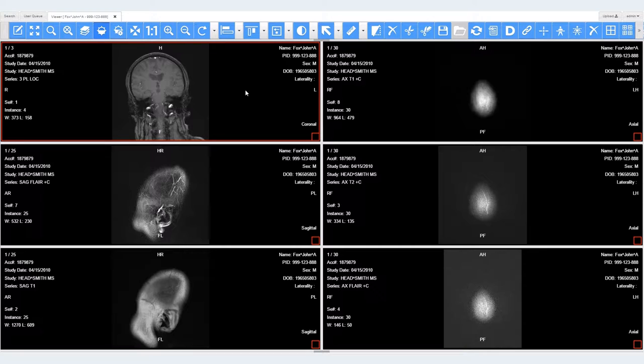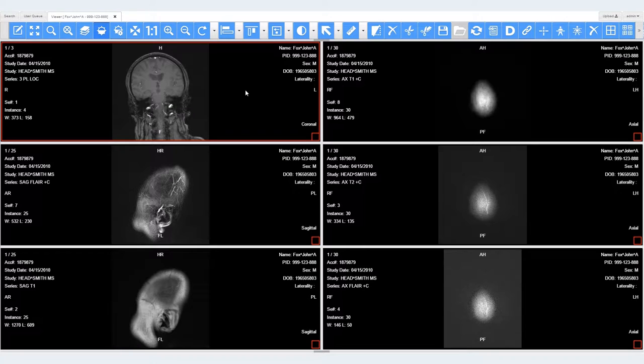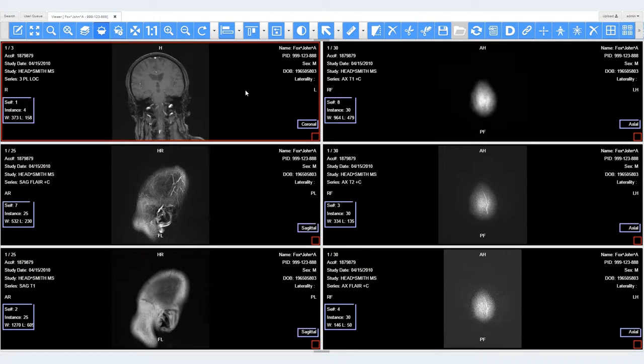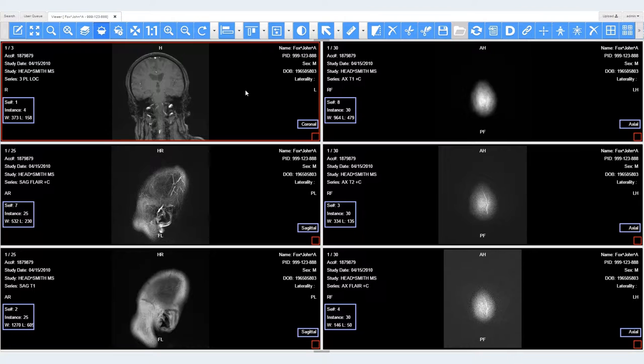For example, we have displayed six series from a head MRI with three planes and varying window level values. Two series share the sagittal plane and three series share the axial plane.